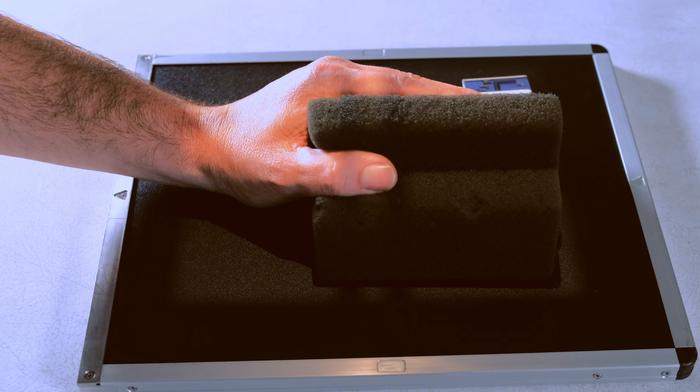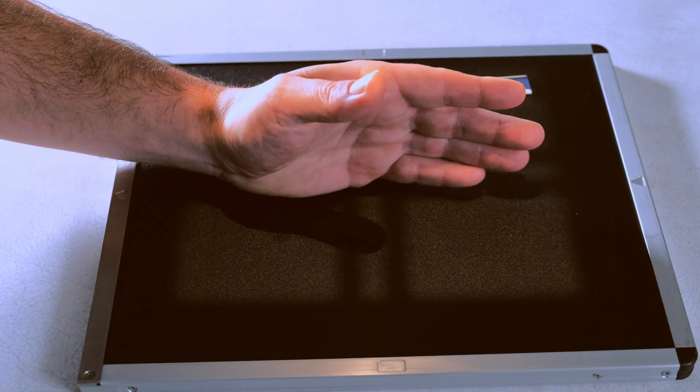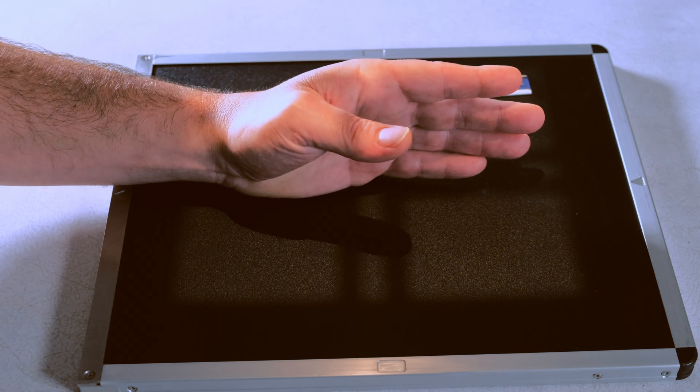The last one we're going to do is a lateral. It's a lateral to medial lateral and the central ray is also the second MCP joint. This concludes our three view hand series at Modern Technology School. Coming up next will be a wrist series.